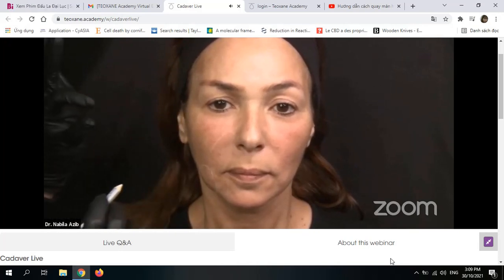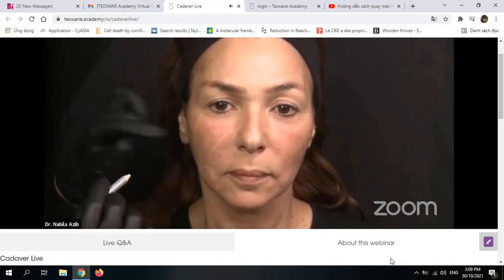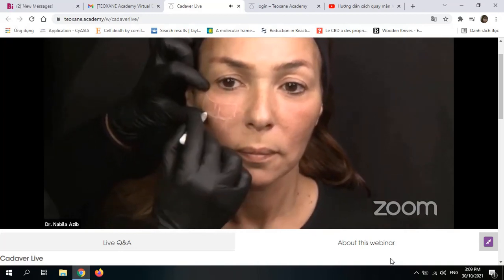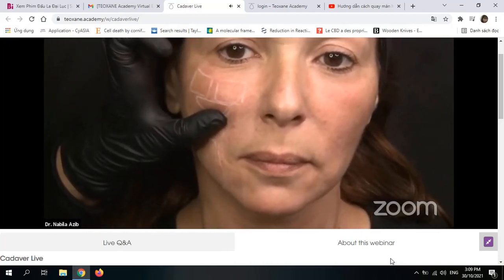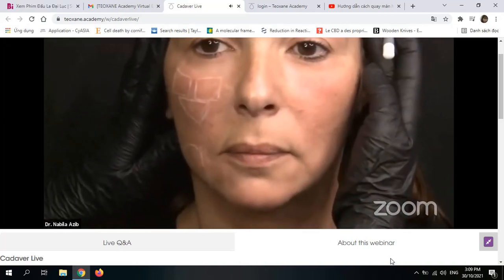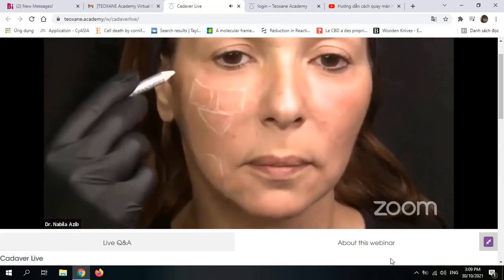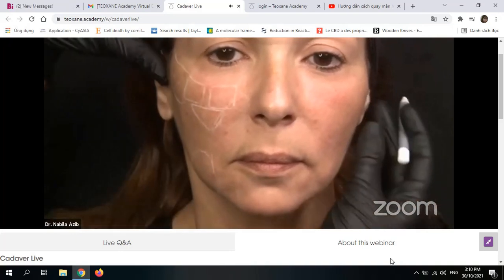So I will be starting by improving the mid-face. That will be my starting point, because by improving the medial SOOF here and the lateral SOOF and the deep medial cheek fat compartment, I will get a bony restoration of her mid-face. But if you look at her, she's quite asymmetric. The lateral cheekbone on her left side is more pronounced than on her right side. So I will need to add other boluses on the zygomatic arch here to have a better symmetry with the other side.